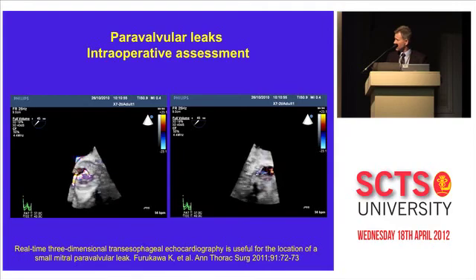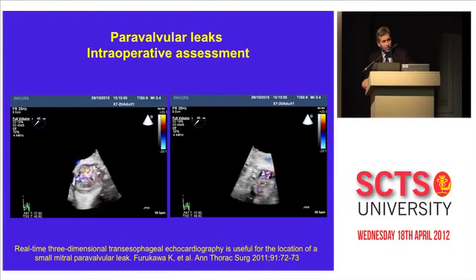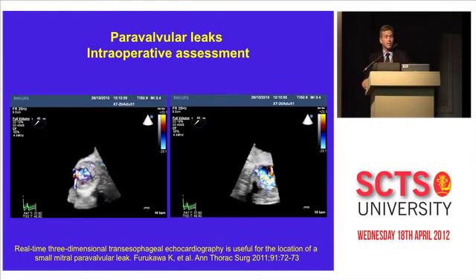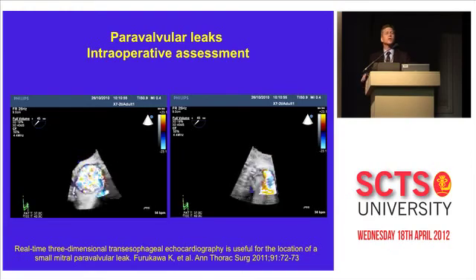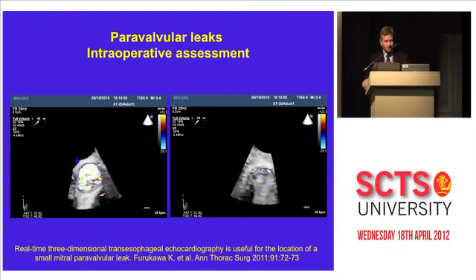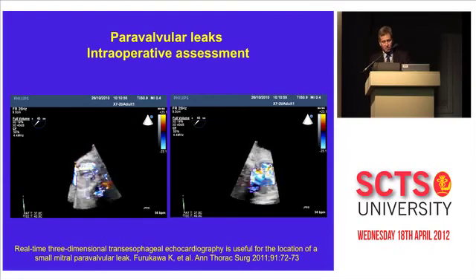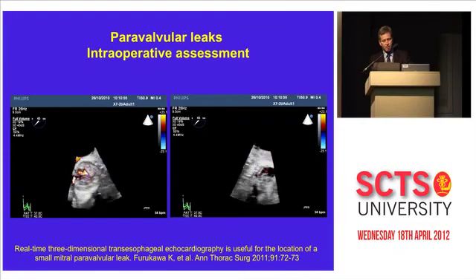The surgeon has to deal with. Now, I think 3D echo makes a huge difference, and it's also been shown in a few publications where people looked at paravalvular leaks and feel we can quantify much better with 3D, especially the Doppler color of 3D. The reason being, you can pinpoint the specific origin, the specific pinhole of that paravalvular leak, just there where the left coronary artery comes off, on the posterolateral side of that aortic annulus.